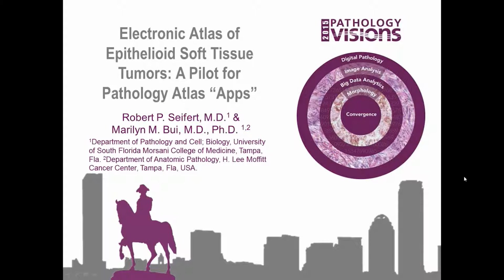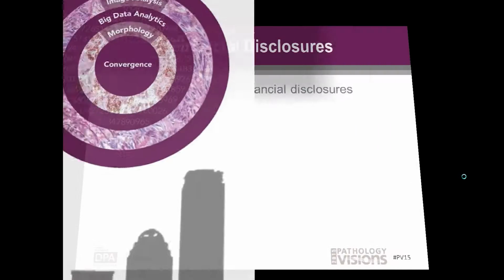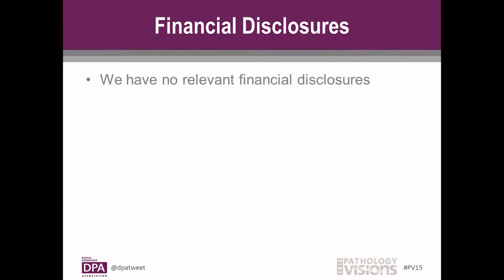My topic is an electronic atlas of epithelioid soft tissue tumors, a pilot for Pathology Atlas apps. We have no relevant financial disclosures.